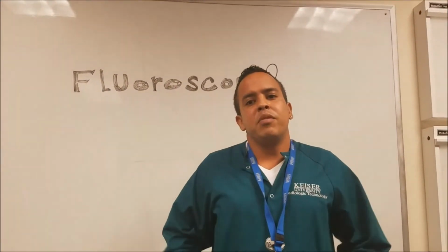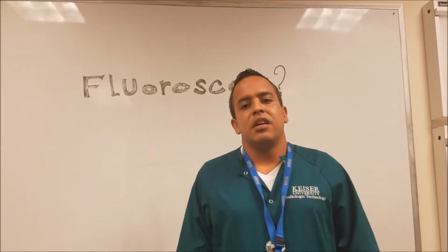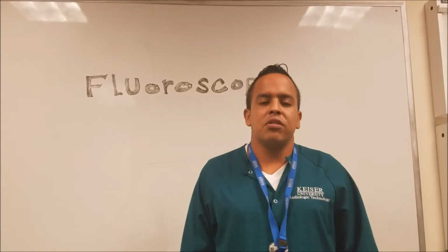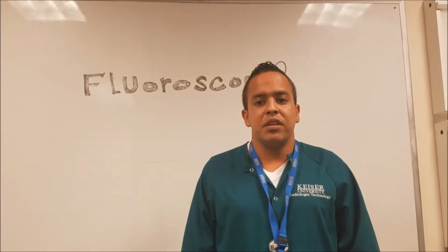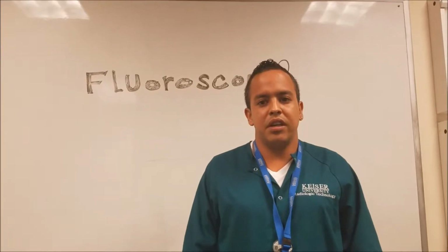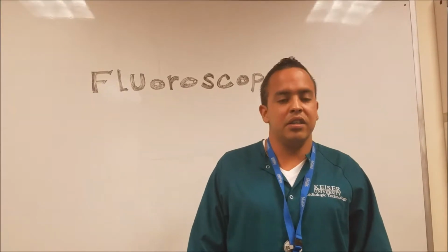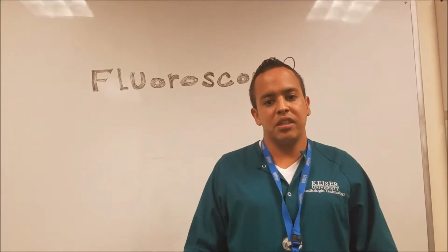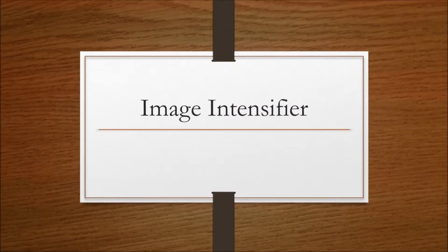The Food and Drug Administration (FDA) provides the following definition of fluoroscopy: a type of medical imaging that shows a continuous X-ray image on a monitor, much like an X-ray movie. The X-ray beam passes through the body and the image is transmitted to a monitor so that the movement of a body part, instrument, or contrast agent, like an X-ray dye, in the body can be seen in detail.